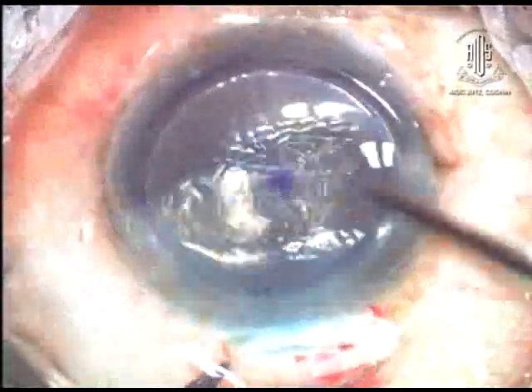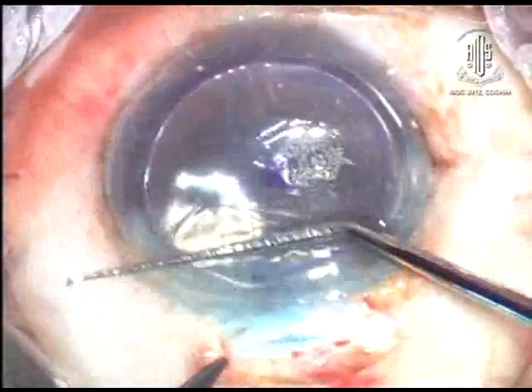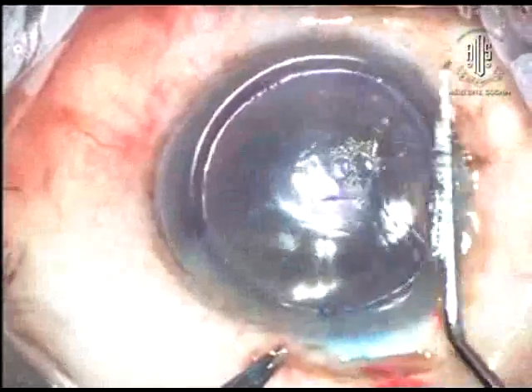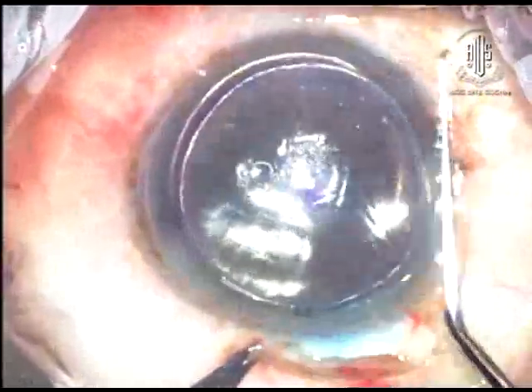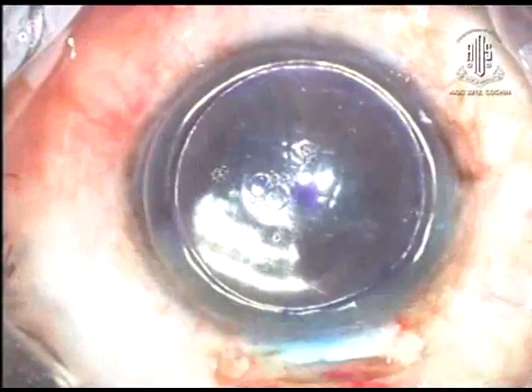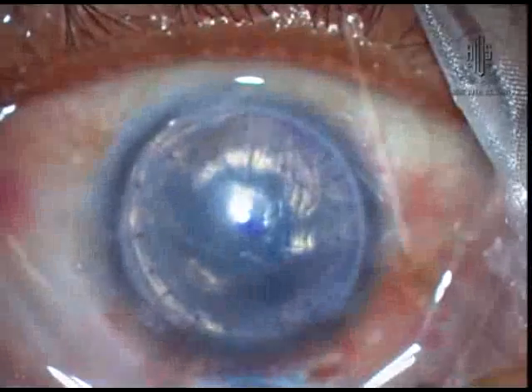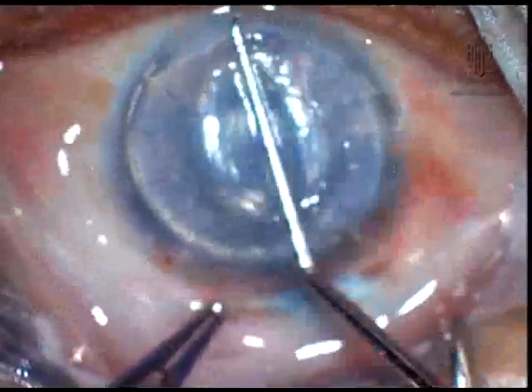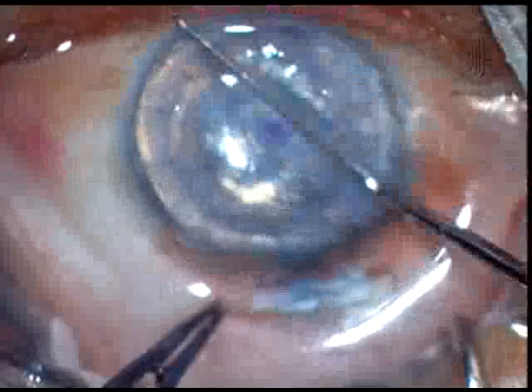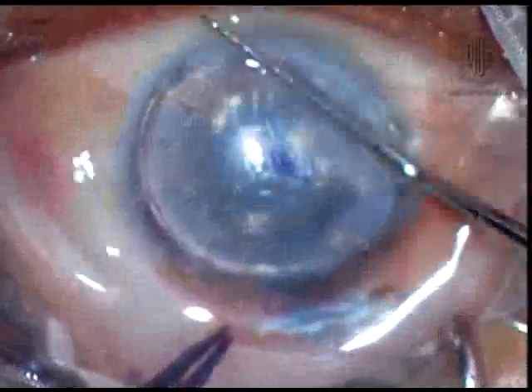Number 6. Centration of donor tissue. In routine DSAEK cases, gentle external massage with a round instrument brings the graft at the center with uniform golden ring all around. In post-PK DSAEK for smaller or same size graft with smooth posterior surface, this is not a problem. Gentle massage till the appearance of the uniform golden ring.